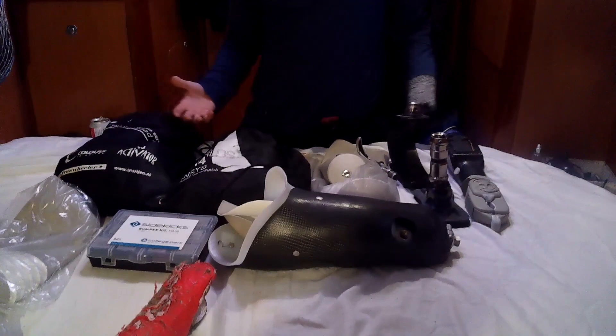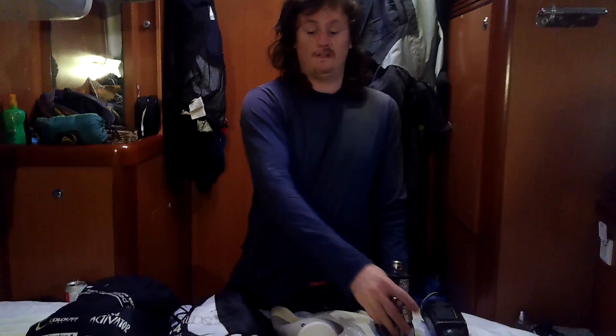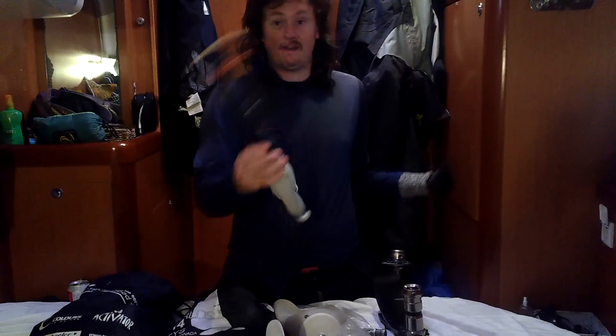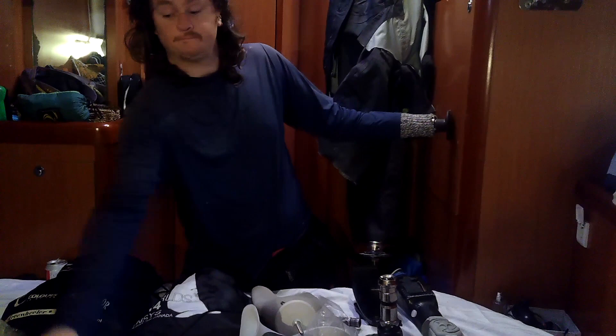I got asked the question the other day online about what prosthetics I have, what care I do to my prosthetics, and what repair kits and spares I have. So these are one of each of my spares. I've got spare liners, I have spare feet - different feet - I have spare sockets in case mine break. I have completely spare arms. This is a myoelectric gripper; it opens and closes with the sensors on my arm. I have spare arms as well.